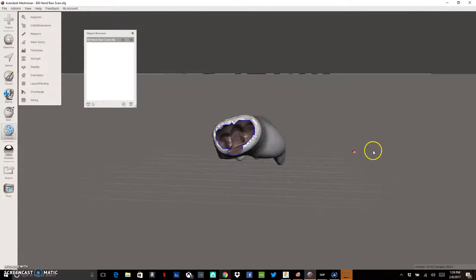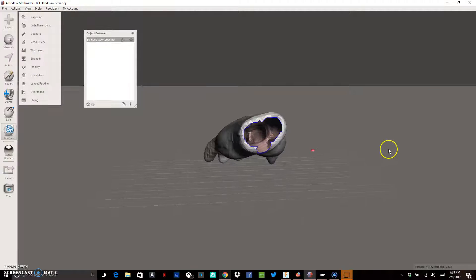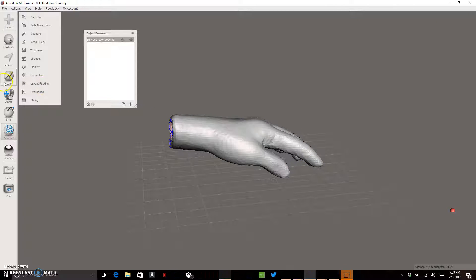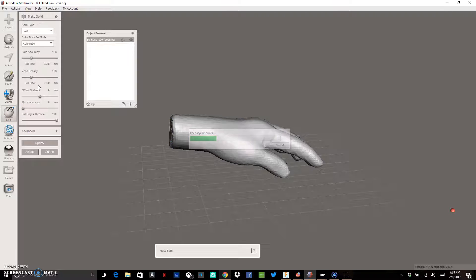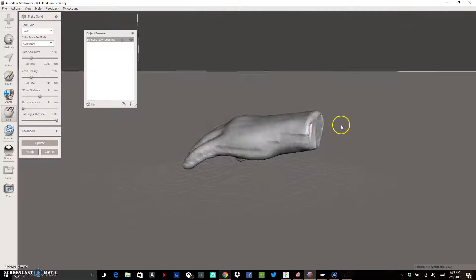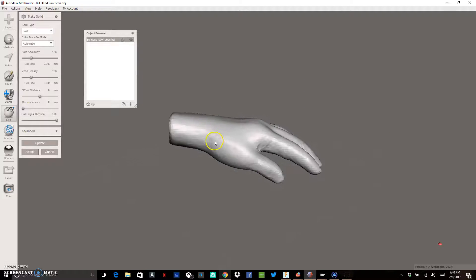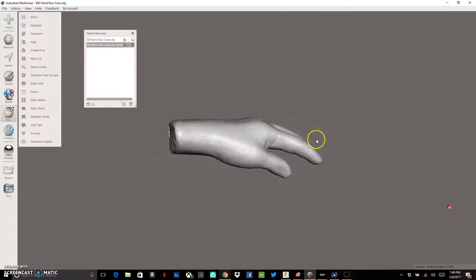You'll notice the scan is kind of hollow on the inside. The first thing we want to do is close that up and make it solid. Go to Edit and then Make Solid. It's going to give you a fast version and solidify all of this. That looks fine, so we can accept that and now we have a solid model.